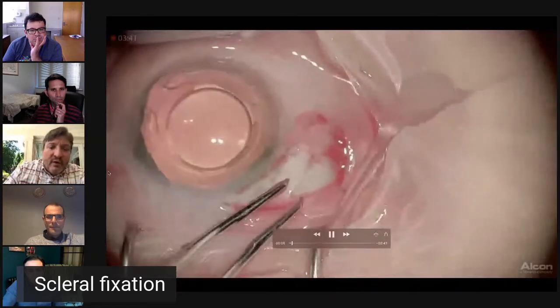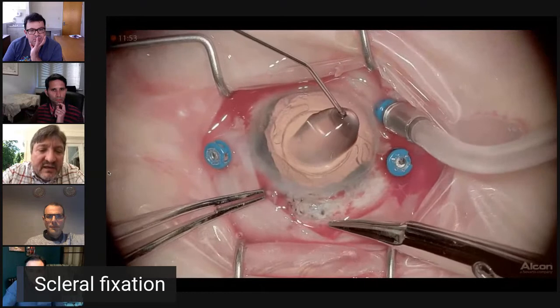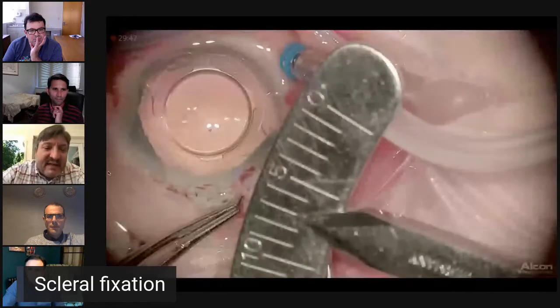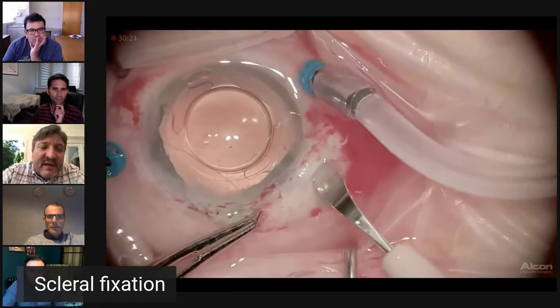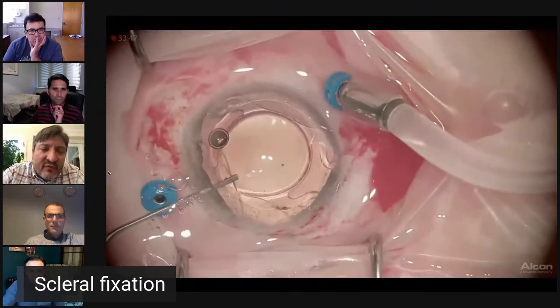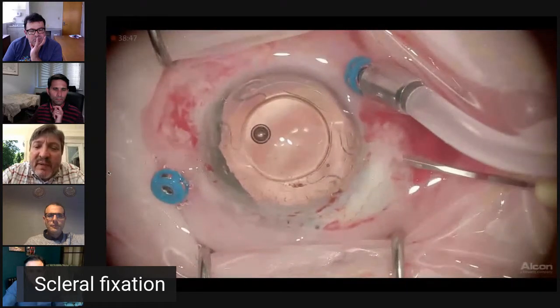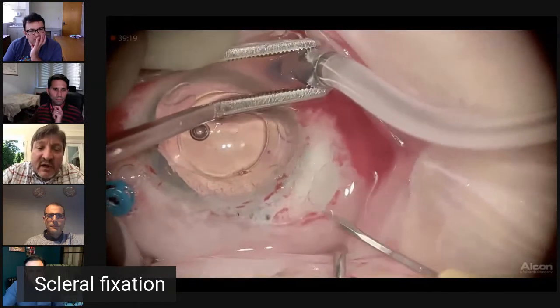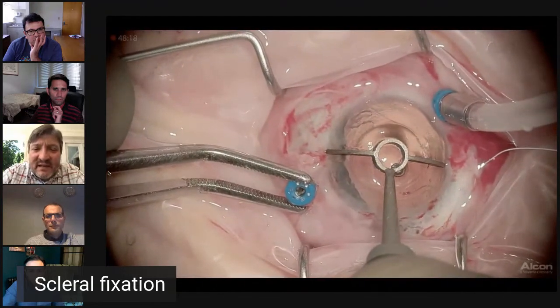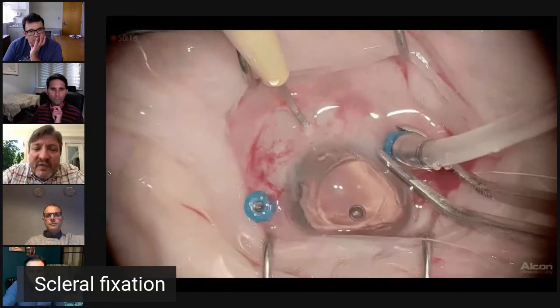So we're opening the conjunctiva, exposing the previous Gore-Tex sutures. Here you see the phaco burn and the mangled area where the iatrogenesis imperfecta originated at St. Elsewhere. So I've got a kind of going in at a weird angle. Here's my scleral tunnel that I really prefer to do for any kind of IOL cases. We opened the wound to 7 millimeters, and here are my two sets of sclerotomies. So here's one set with a loop of Gore-Tex in one and out the other. I'm using this toric alignment marker to really make sure that I'm 180 degrees away with the opposite sclerotomies.